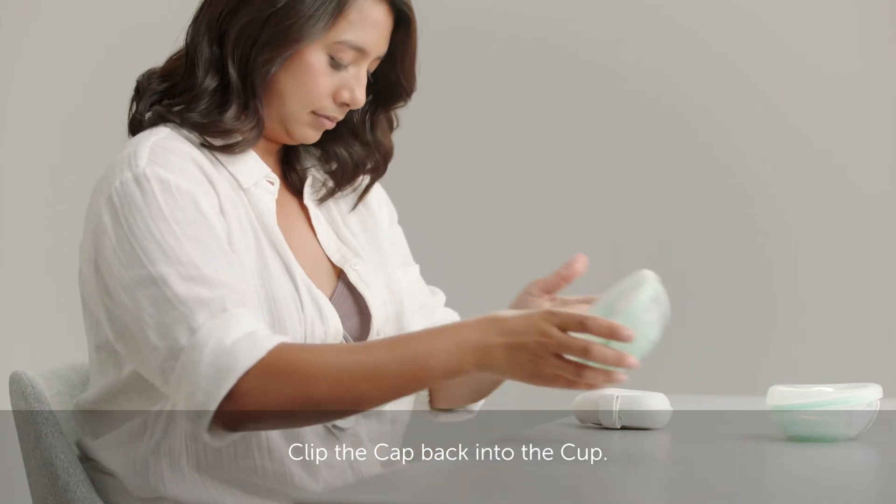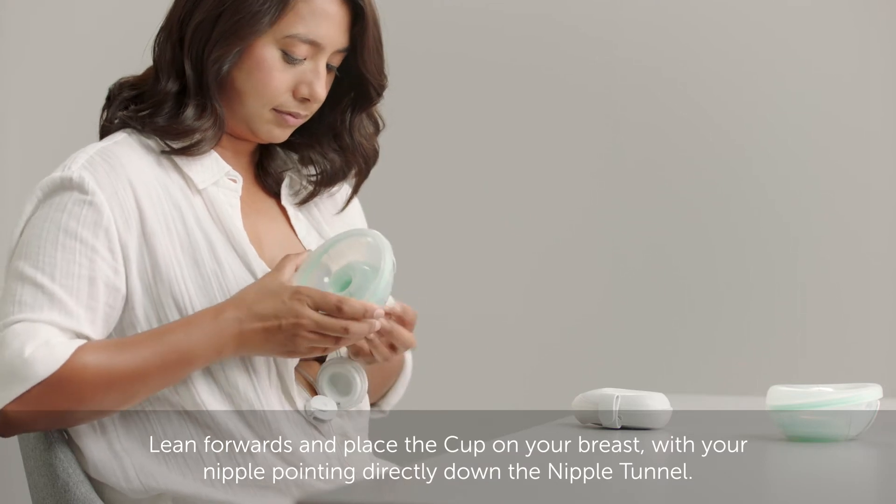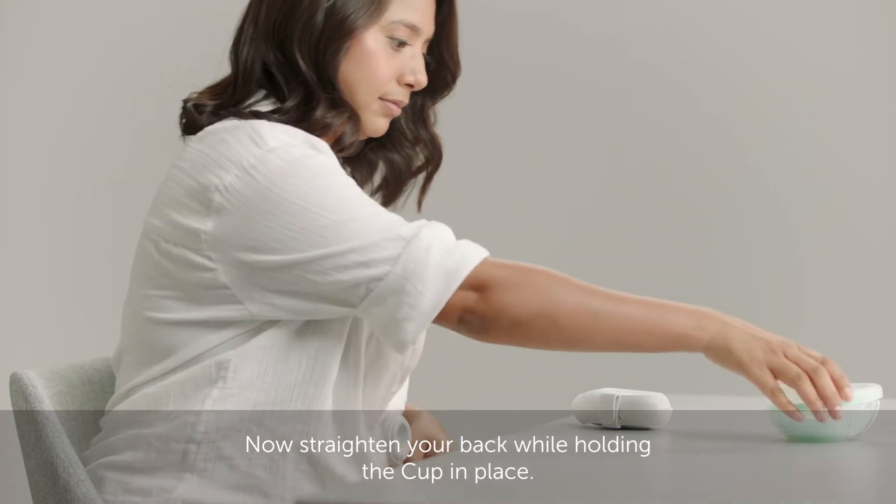Clip the cap back into the cup, lean forwards and place the cup on your breast with your nipple pointing directly down the nipple tunnel. Now straighten your back while holding the cup in place.